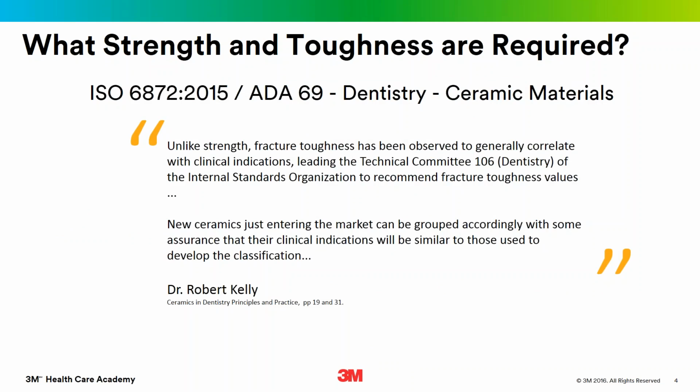In conclusion, as stated by Dr. Kelly, unlike strength, fracture toughness has been observed to generally correlate with clinical indications, leading the Technical Committee 106 Dentistry of the International Standards Organization to recommend fracture toughness values. New ceramics just entering the market can be grouped accordingly with some assurance that their clinical indications will be similar to those used to develop the classification.